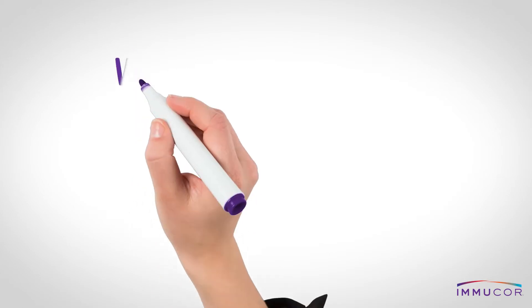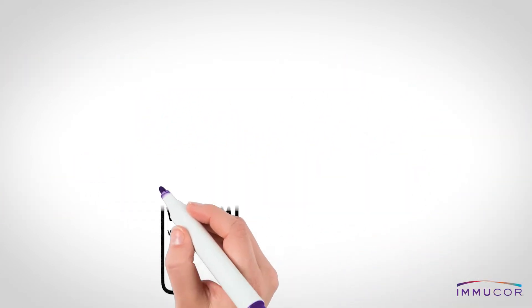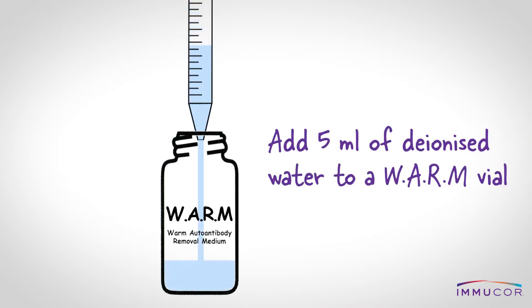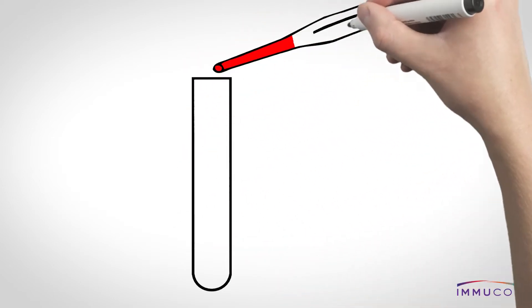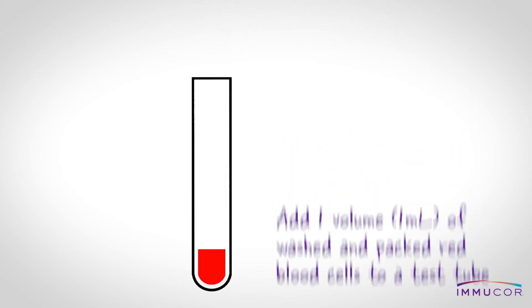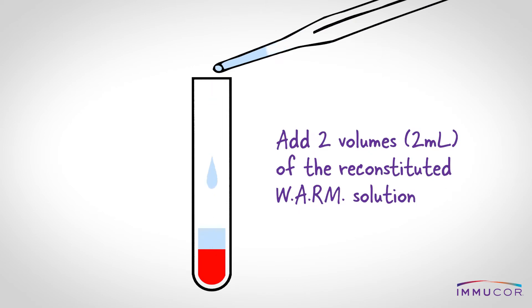I'll now demonstrate the WARM procedure. Reconstitute a vial of WARM reagent by adding 5 ml of DI water. Add 1 volume of packed red blood cells to an appropriately labeled test tube. It is not necessary to wash these red blood cells prior to WARM treatment. Now add 2 volumes of the reconstituted WARM reagent to this tube.